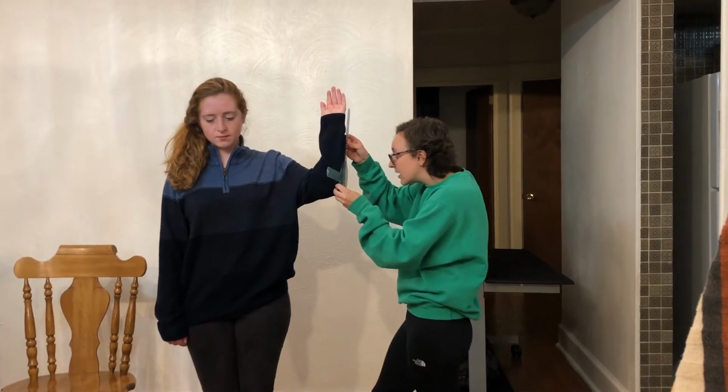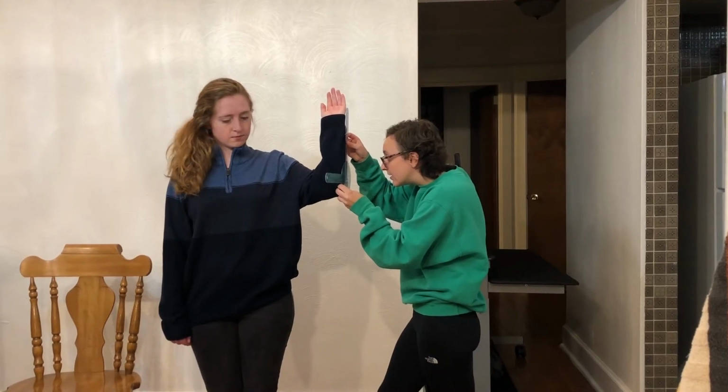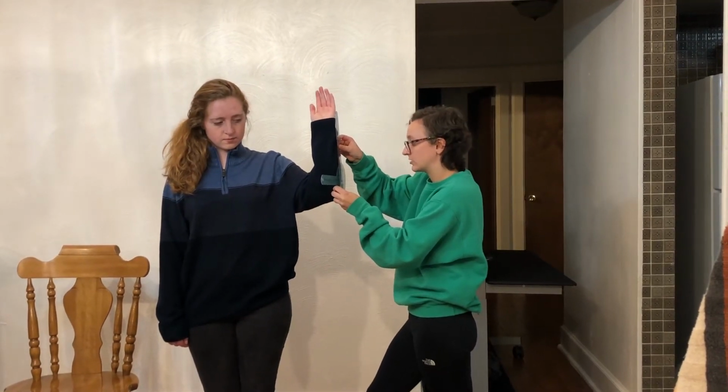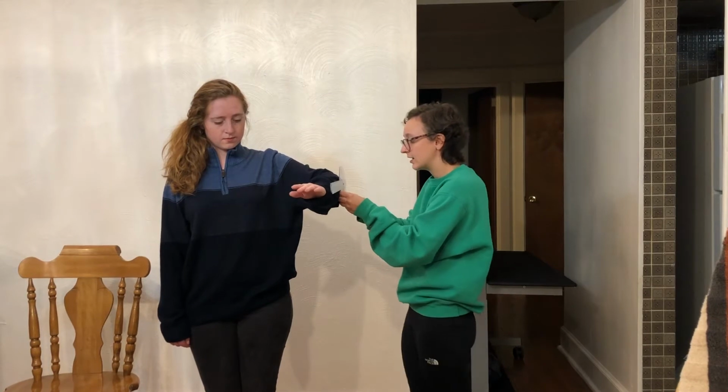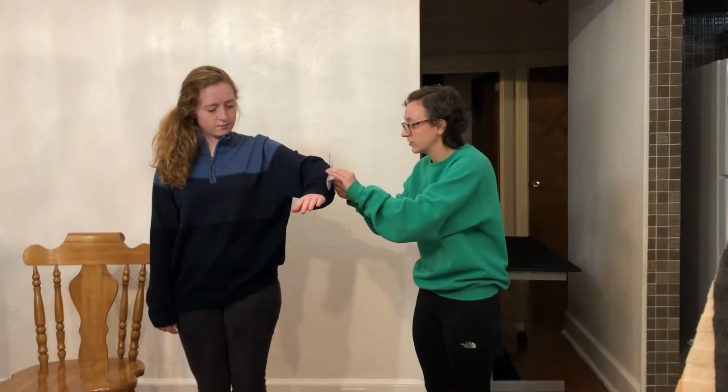Okay, and we're getting 85 for external rotation. And for this one, what I'm going to have you do is rotate your hand down toward the floor whenever you're ready.